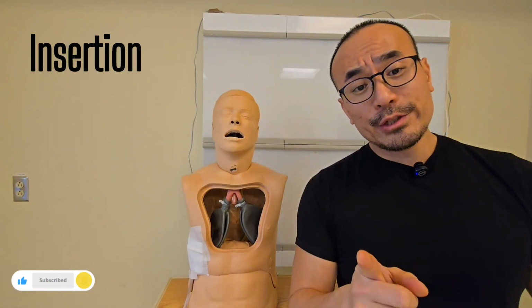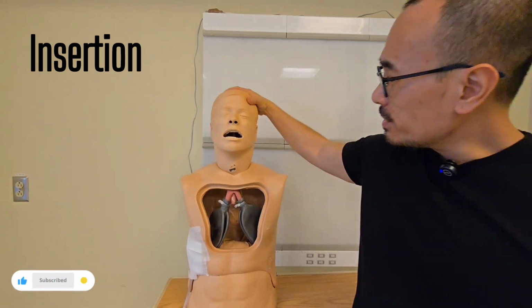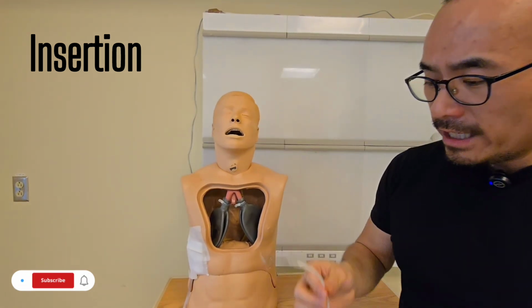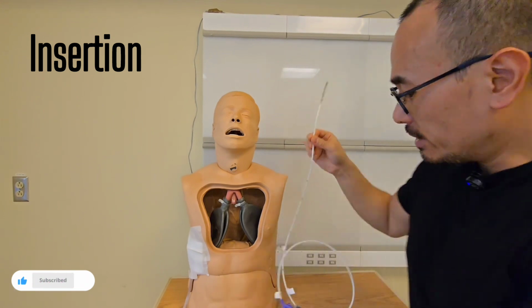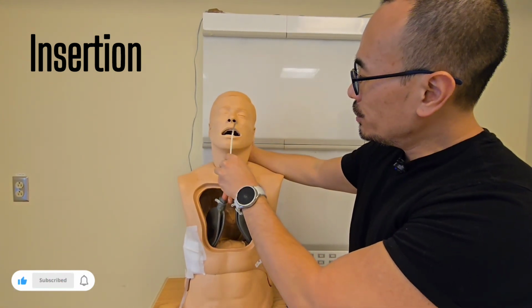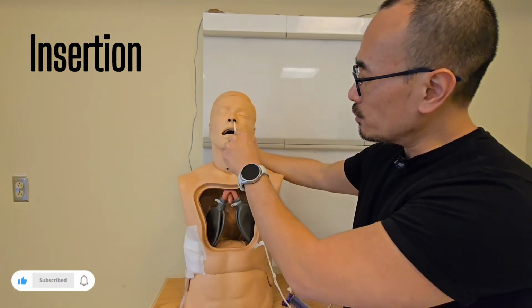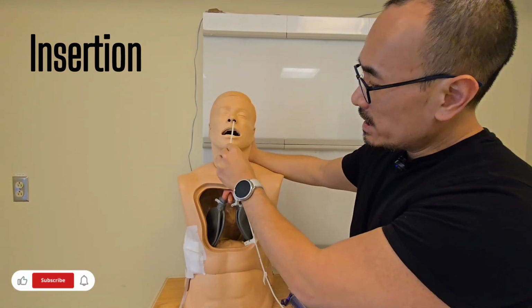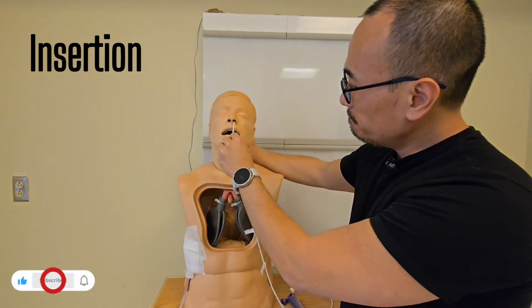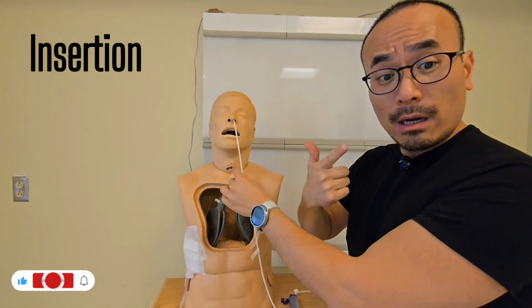All right, as we're ready to insert the NG tube, we are going to ask the patient to just tilt their head back, and we are going to start by inserting the tube slowly. Okay, so we're gonna tell Mr. Smith, we're gonna insert the tube, and when I tell you to swallow, you are going to try to swallow. Okay, so as the tube starts to go into the patient, this is the point where the patient might start grimacing because it's quite uncomfortable.